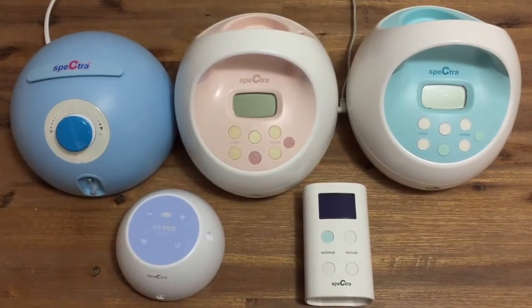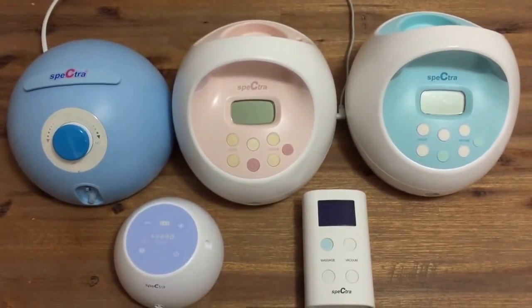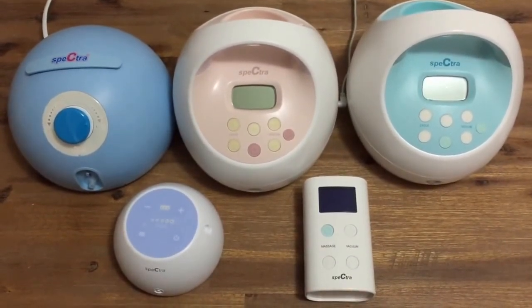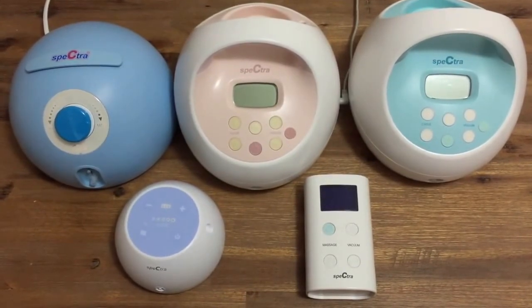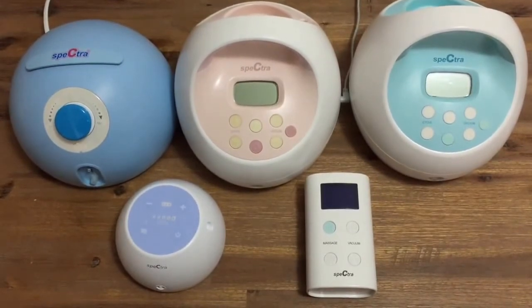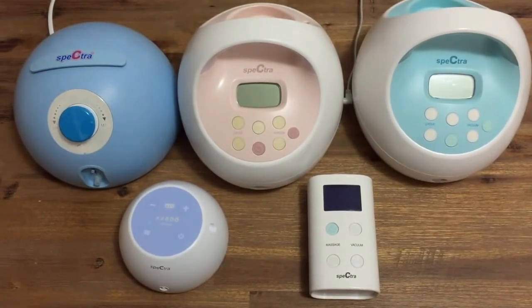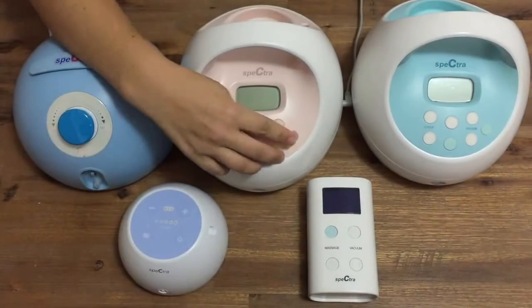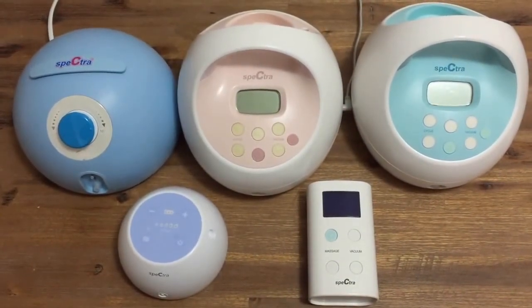The next hospital grade breast pump is the Spectra S2. It's a little more advanced than the G350 and you can vary the suction strength and the cycle speed independently of each other, giving you more control. The Spectra S2 has a let down mode, which is a light fast mode of pumping designed to encourage your milk to flow, and a night light perfect for nighttime expressing. There is also a timer function to help you monitor your pumping times.